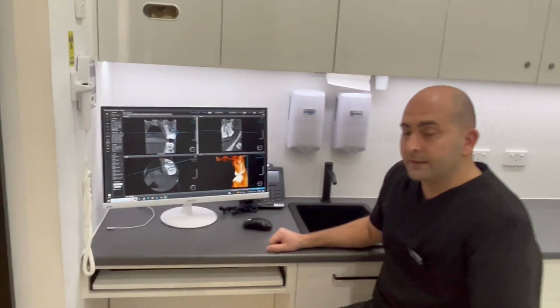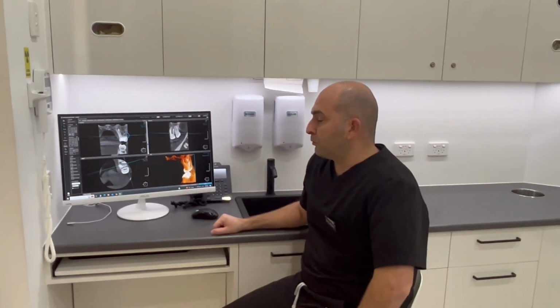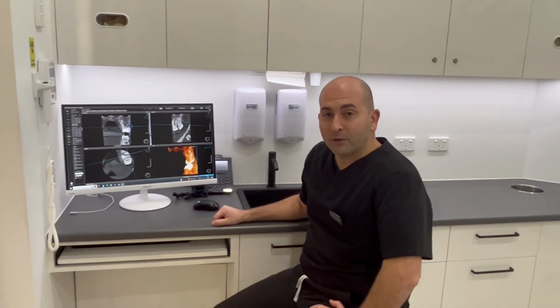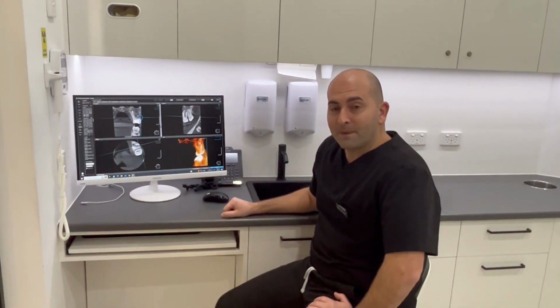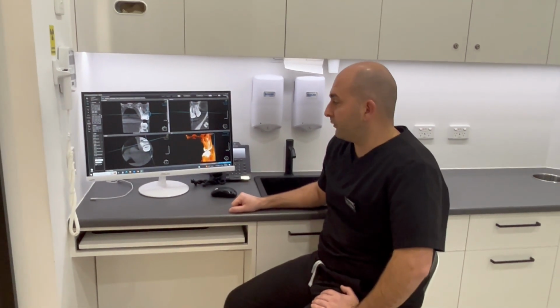Fantastic. And how often are you using the system? I'm using it multiple times a week at the moment. Right. And obviously OPG and ceph is your bread and butter from a day-to-day survey. We use it quite a lot.